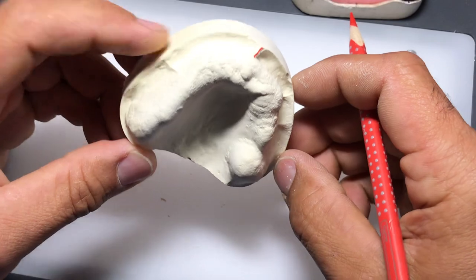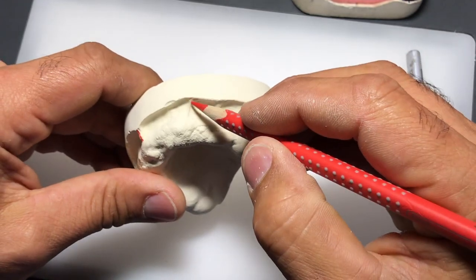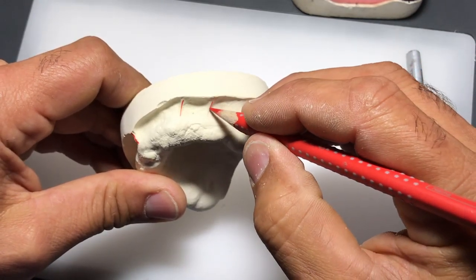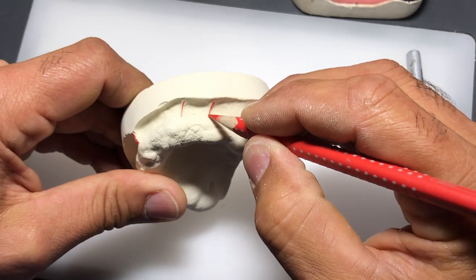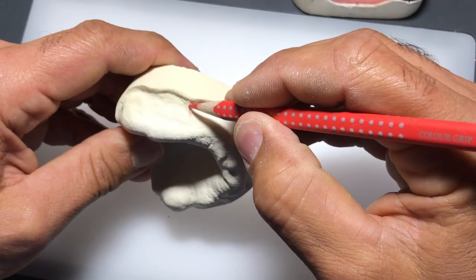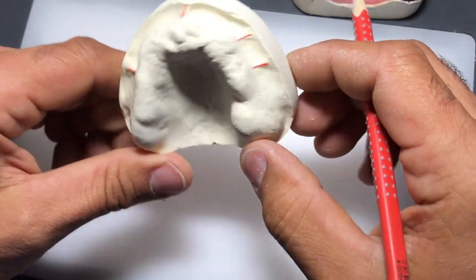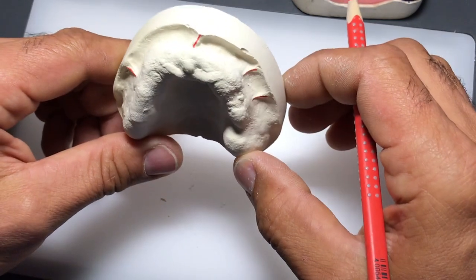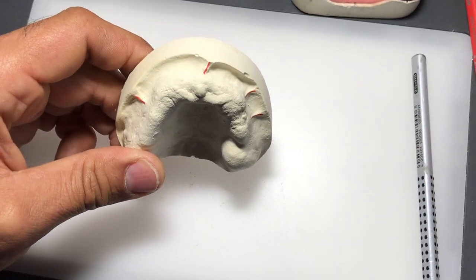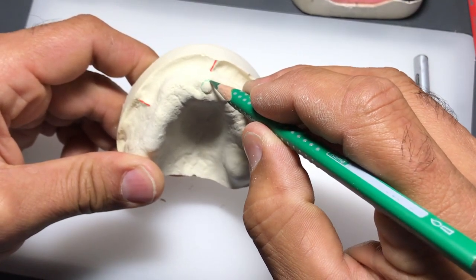There are also a couple of other frenums on the side of the model - the buccal aspect - called the buccal frenums. Sometimes you might have one, sometimes two. Usually if there's one on one side there's one on the other, and if there's two on one side there's usually two on the other. I designed this model specifically to cover all aspects of that variability.